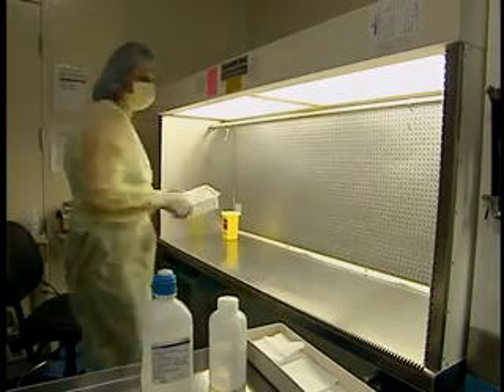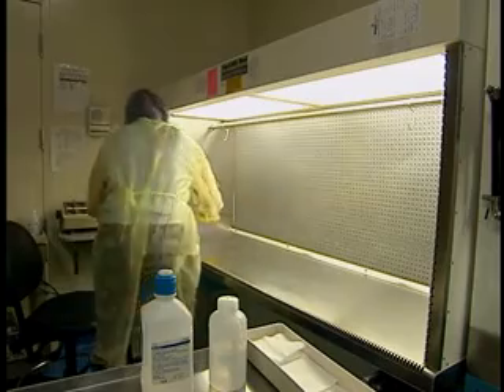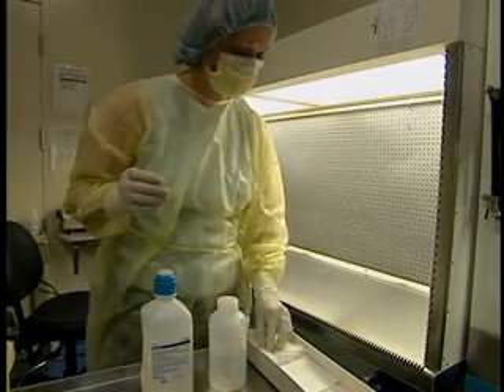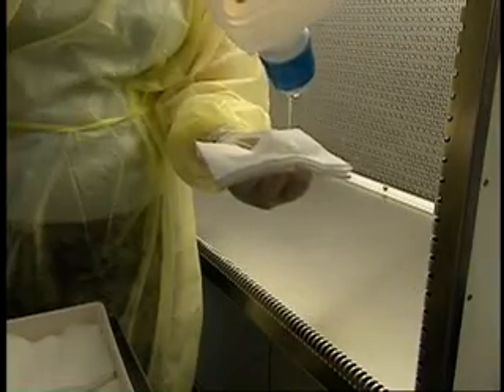The same principles apply when cleaning a horizontal laminar airflow hood as when cleaning a vertical hood. Movements are made in the direction of the horizontal laminar airflow, that is, from the rear of the hood towards the front.